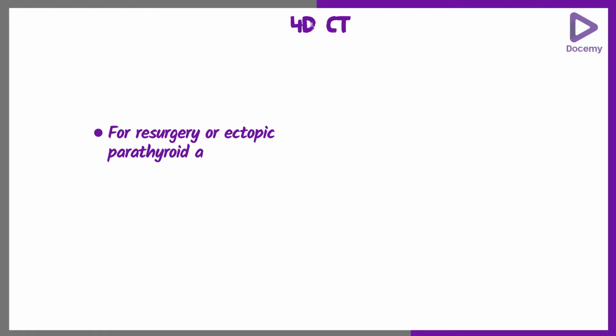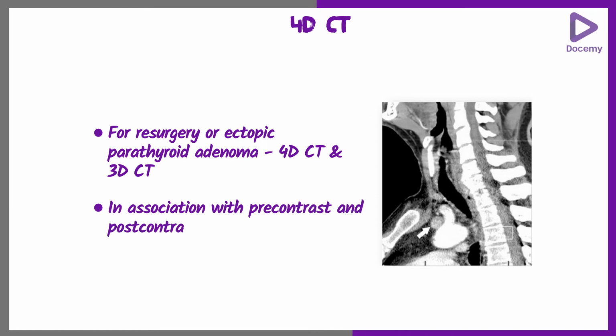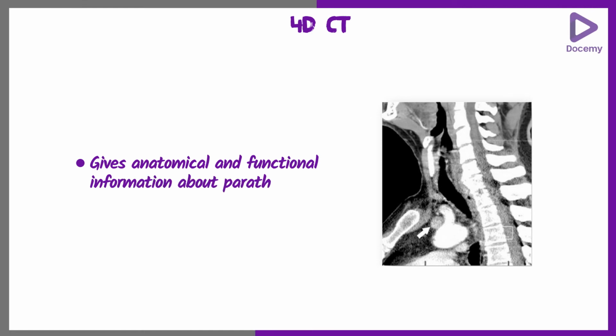In cases of resurgery or in ectopic parathyroid adenoma, you can go for a 4D CT, 3D CT in association with a pre-contrast and post-contrast study of the neck, which gives both anatomical and functional information about a parathyroid adenoma.